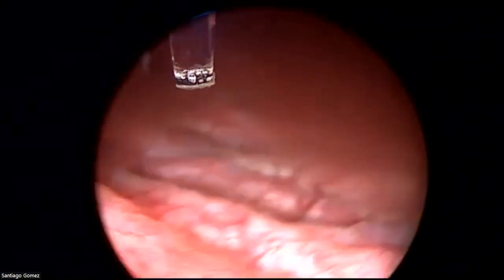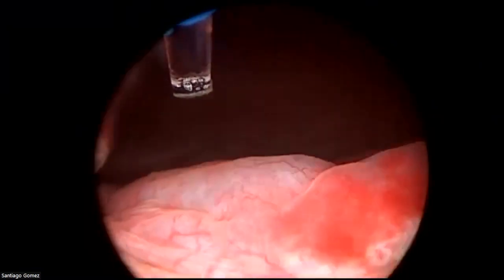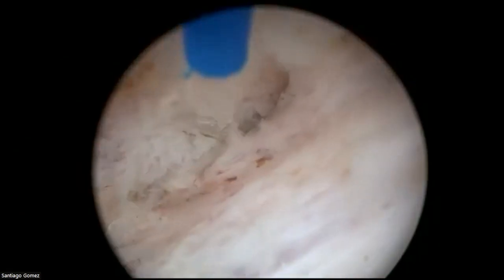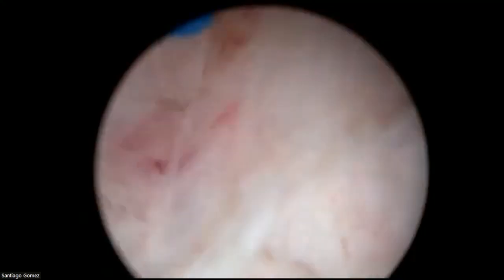Well, all the time you spend watching the UO and knowing where it is, it's a well spent time. There it is. So now you see we are more medial than the UO. Let's go to the other side and see if we can do a similar thing.